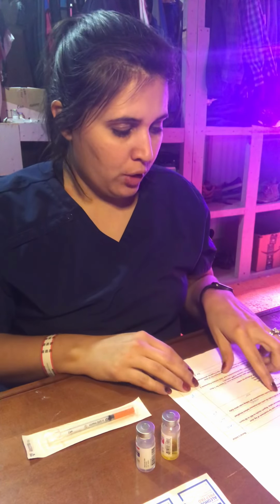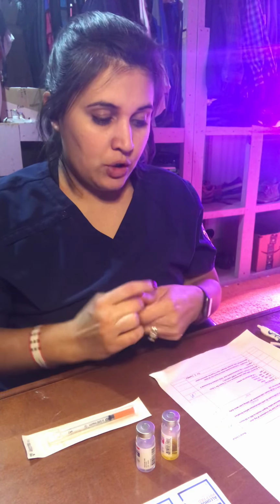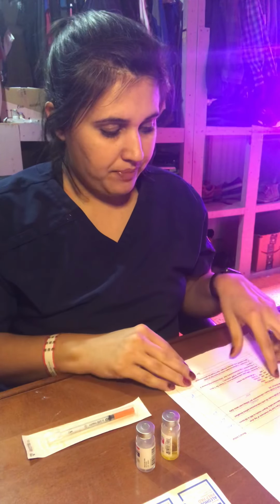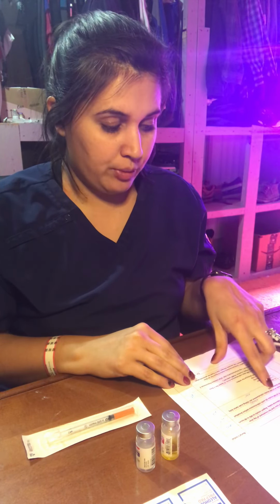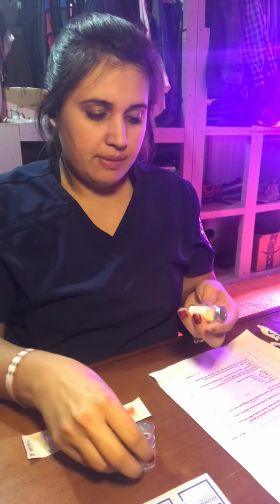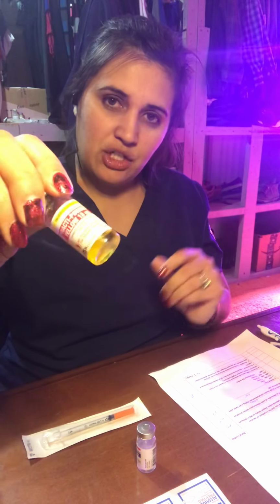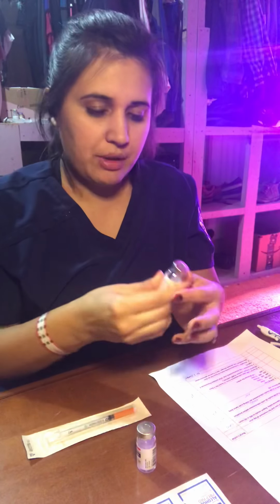The order calls for Humulin NPH unit 100 for 20 units of that subcutaneously, and then for a sliding scale for Humulin R unit 100. So I'm going to get those vials. This is my Humulin NPH. It's cloudy. Pretend it's cloudy and not yellow. It's cloudy. That's what I'm going to use it for.